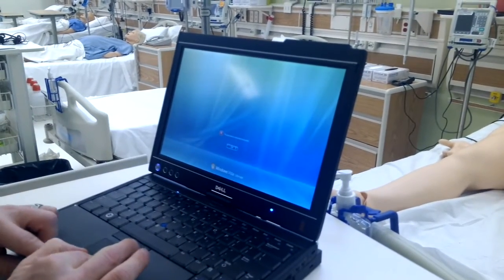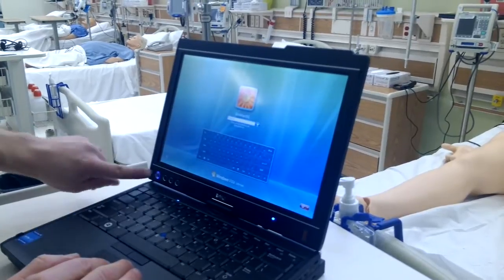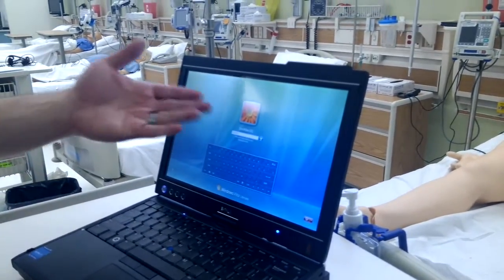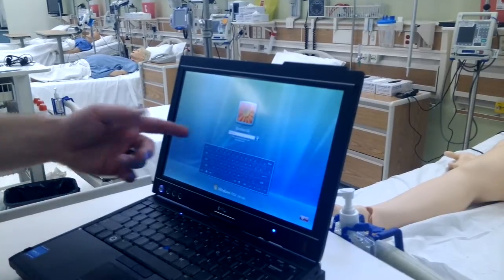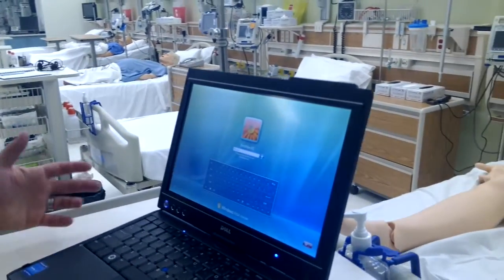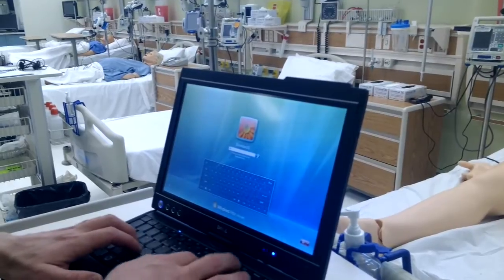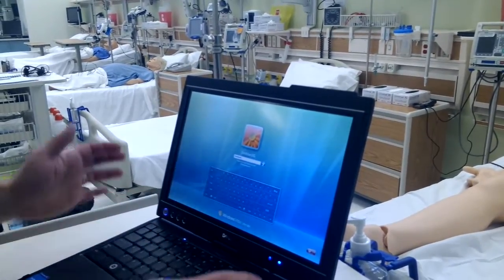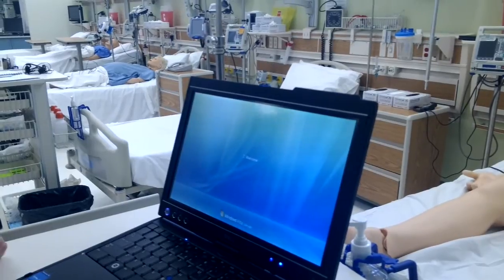It turns on with the power button right there. The bottom left hand side of the screen will bring you to the login. The username is SimMan 3G, the password is the exact same. It's case sensitive, so just copy exactly what you see there and it will log in.